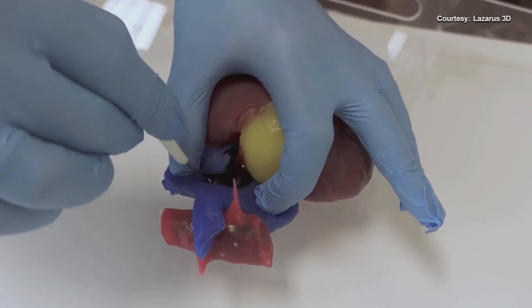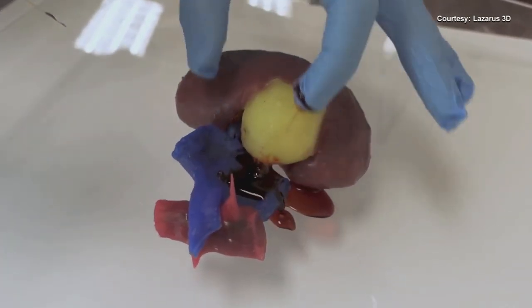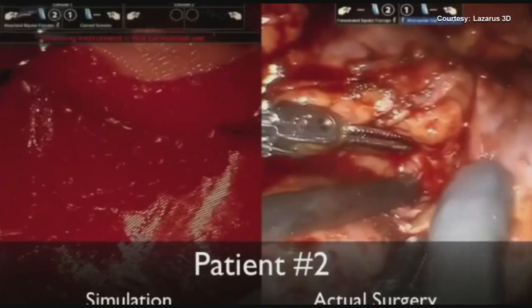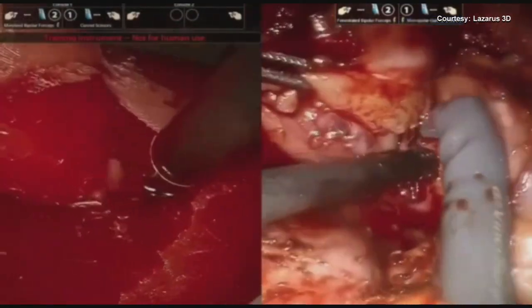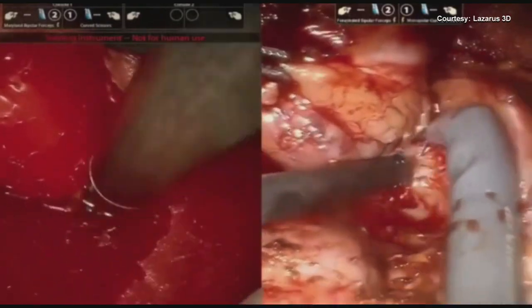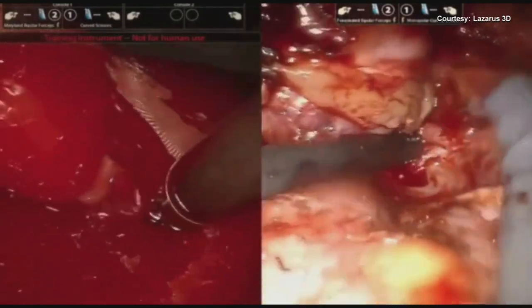The models even bleed and have tension like real organs, giving doctors a lifelike feel. The PRE-SHURE model and the doctor's rehearsal is on the left; the actual surgery is on the right — and the practice and the procedure look almost identical.